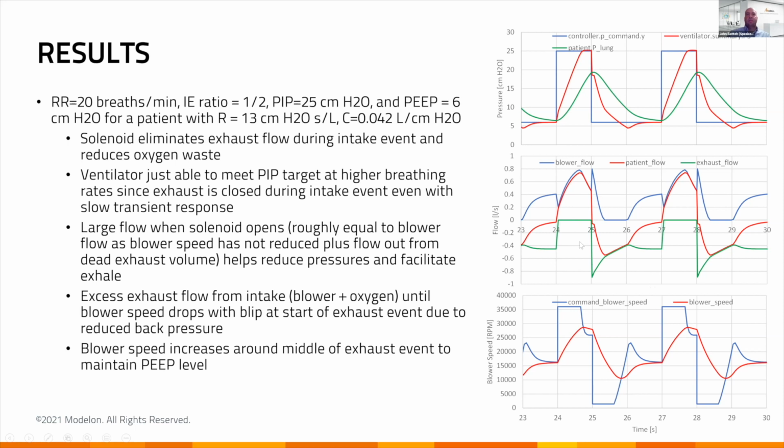You also see there's a large flow when the solenoid opens, and that's because you've got basically two valves open at the same time, and so you do see some flow that comes out. But this is actually not a bad thing. This actually helps reduce pressures and facilitate the patient's breathing event.